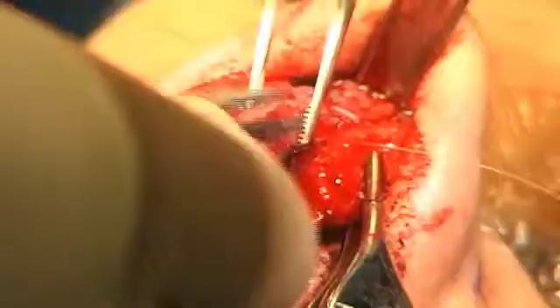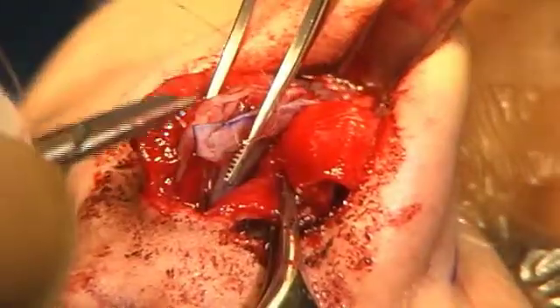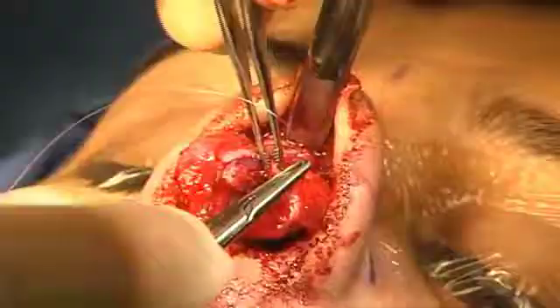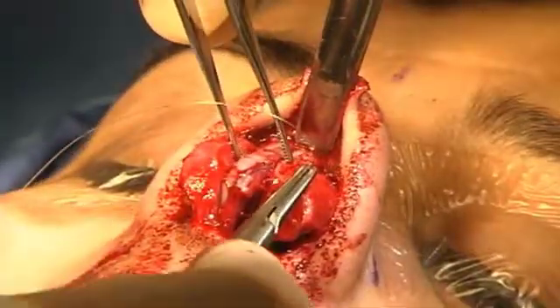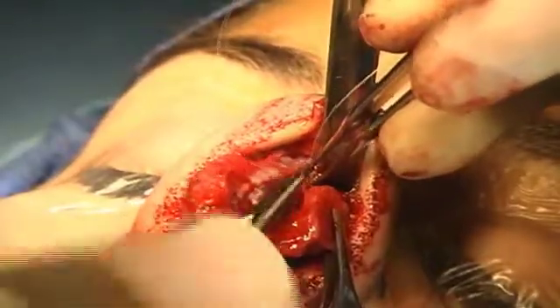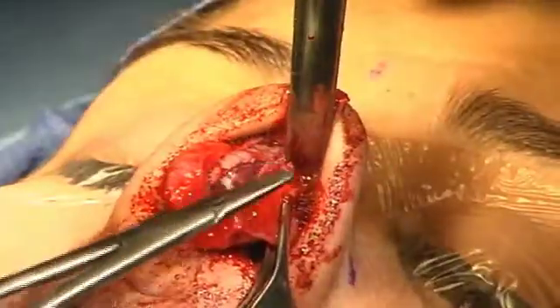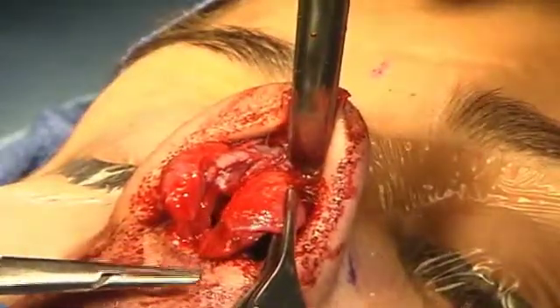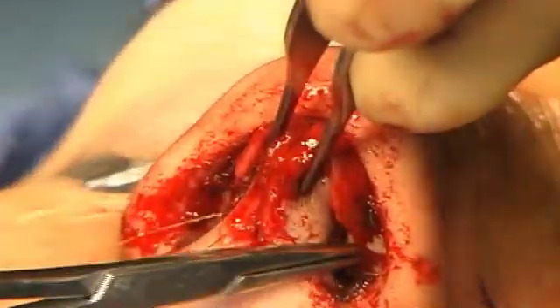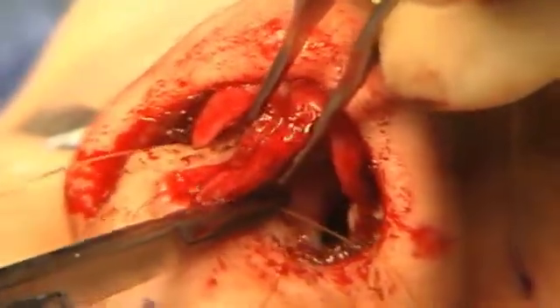The areas of contact include the spreader grafts, the caudal replacement graft, the dorsal remnant, and the opposite splinting graft. The upper lateral cartilages are reconstituted onto this graft. This was a particularly satisfying case as the caudal septal component was completely replaced into its original position, except for alleviation of the original angulation, which was too great to be corrected by a less involved technique.